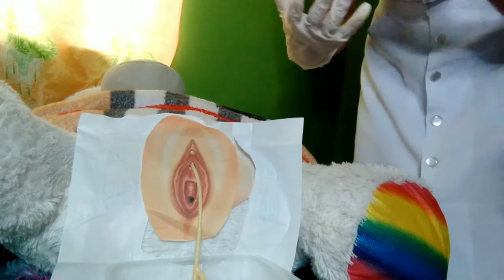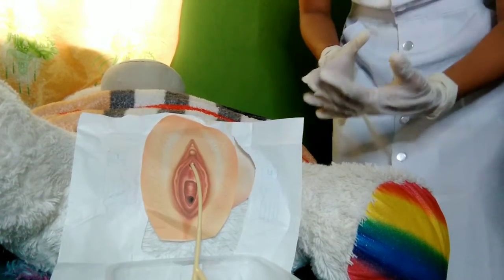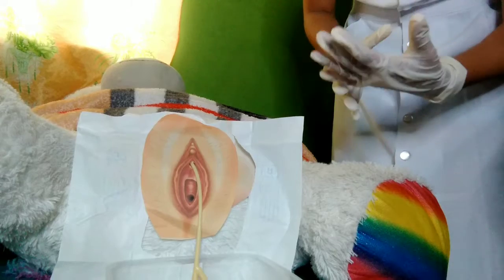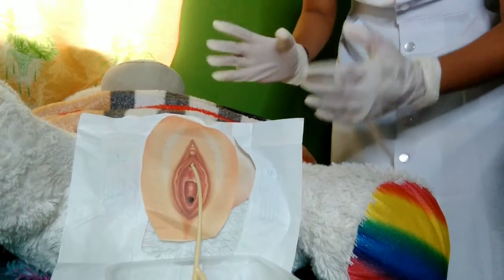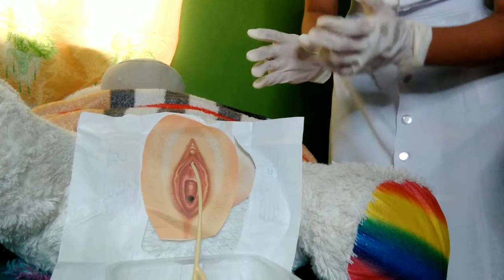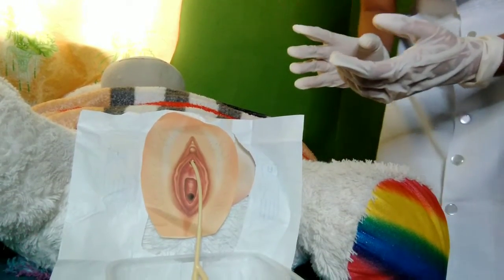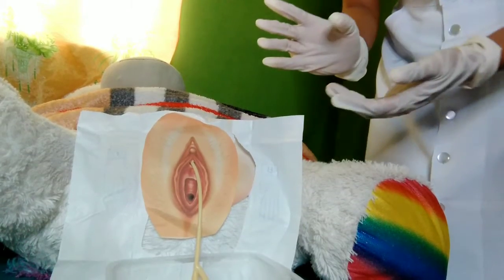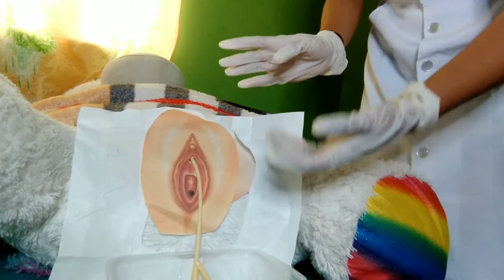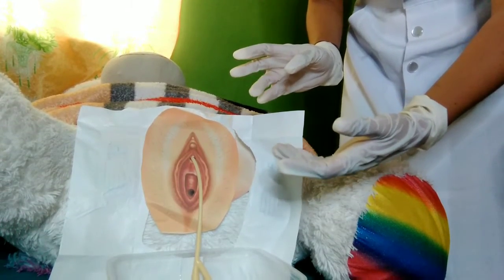So note, if the urine does not appear in a female patient, the catheter may be in the patient's vagina. You may leave the catheter in the vagina as a landmark and insert another sterile catheter. So 22 is to place the catheter in the sterile tray and collect the urine specimen if required.